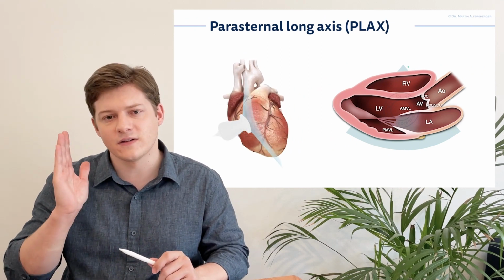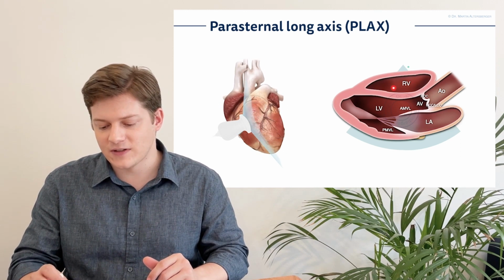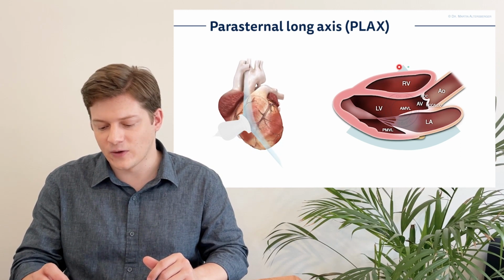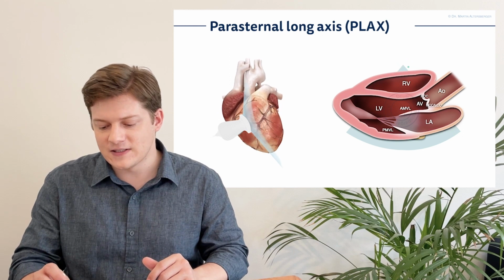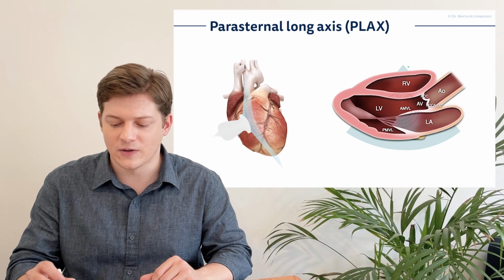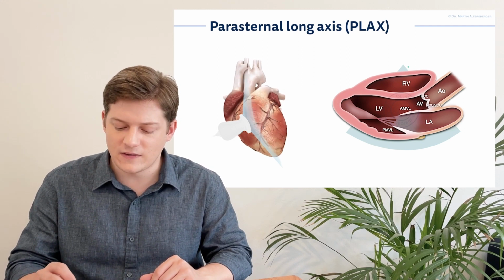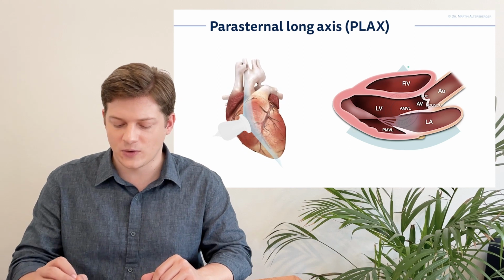Here you see this nice cut plane of the heart, and over here the right ventricle is located, so this is close to the transducer. This is the mark of the transducer. In echocardiography, the marker is always on the right side of the image, and it is close to the transducer. And this is your field of view you can acquire.